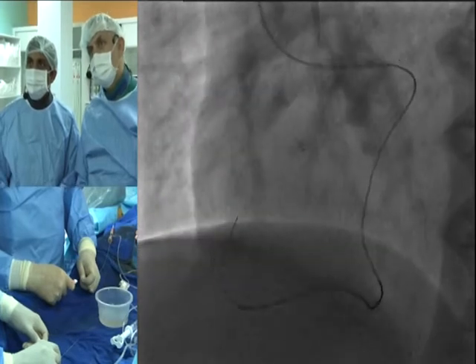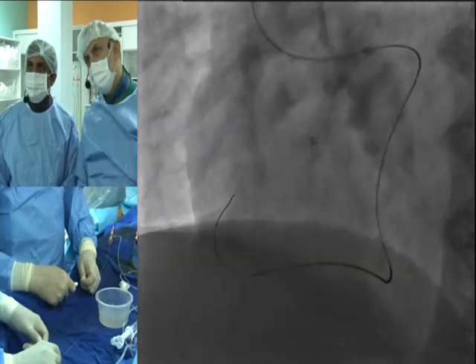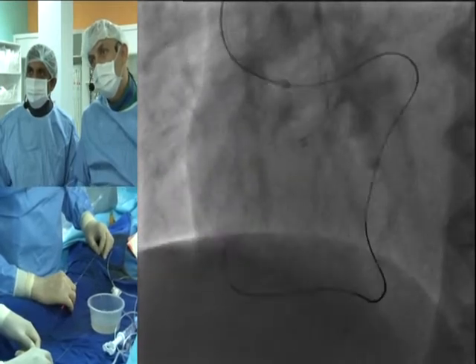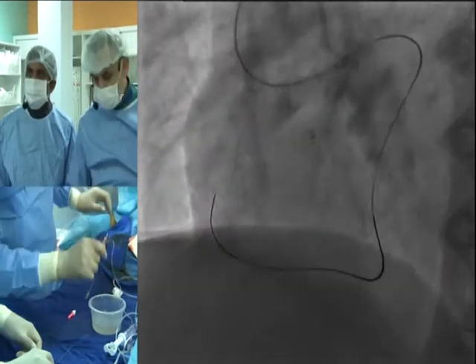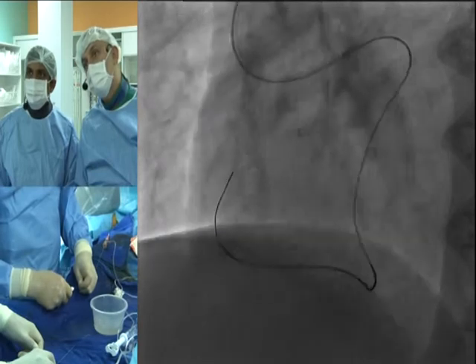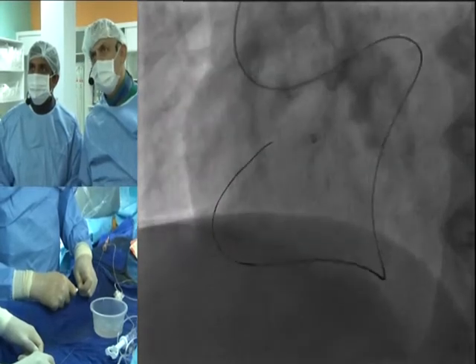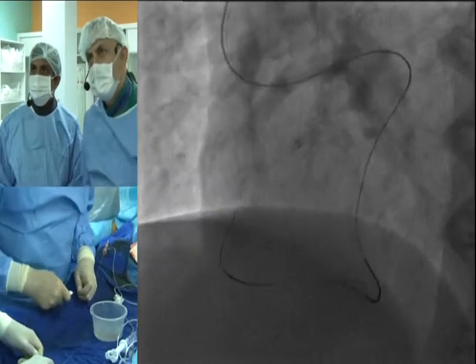Now I'm touching something different. I feel that. And the path also appears to be slightly different than before. I'm pushing my Corsair to have better support because I feel the resistance there. Different part of the distal CTO cap. But now I'm in the same path, I think. I just jumped to the same.